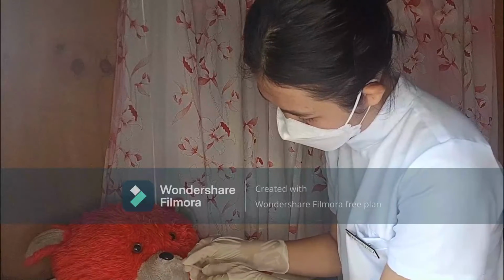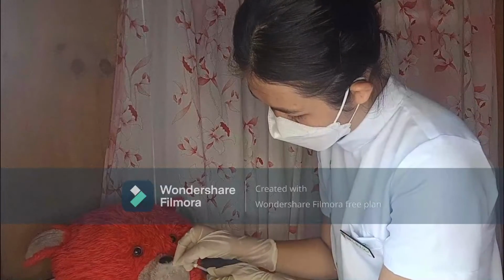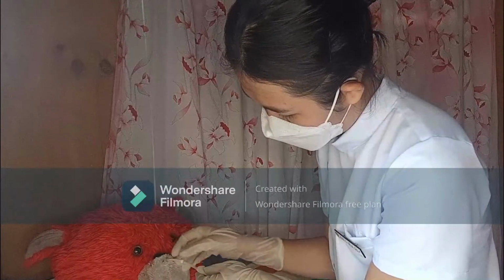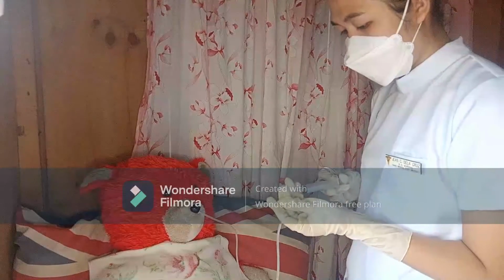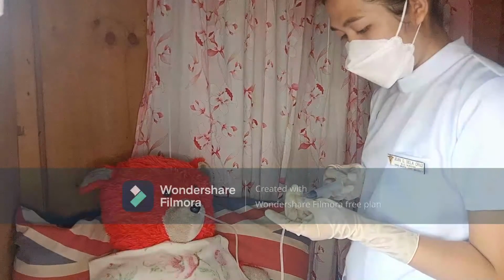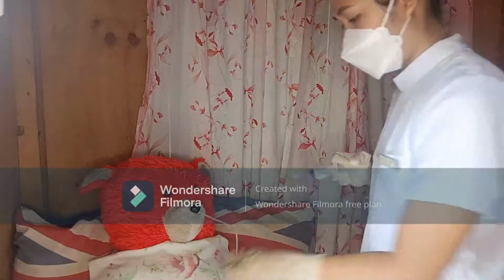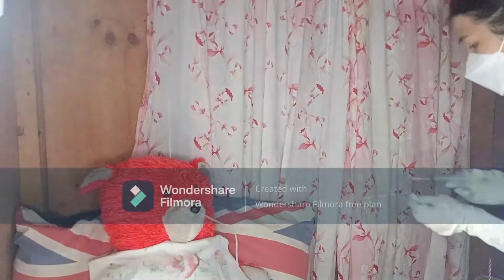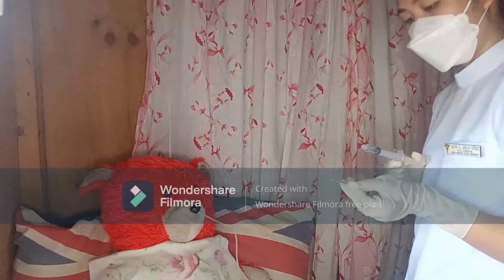Then, ascertain correct placement of the tube. Nasogastric tubes are radiopaque and position can be confirmed by an X-ray. Aspirate stomach contents and check the pH, which should be acidic. Aspirate can also be tested for bilirubin. Bilirubin levels in the lungs should be almost zero, while levels in the stomach will be approximately 1.5 milligrams per dL, and in the intestine more than 10 milligrams per dL.